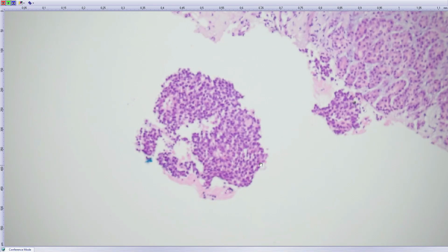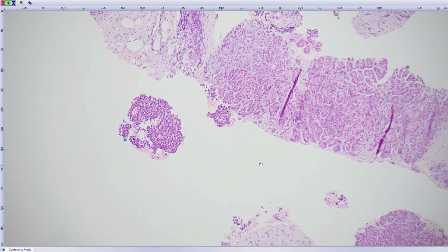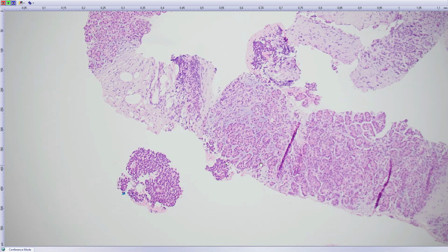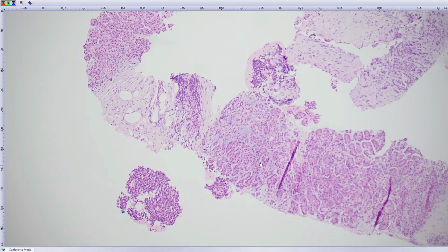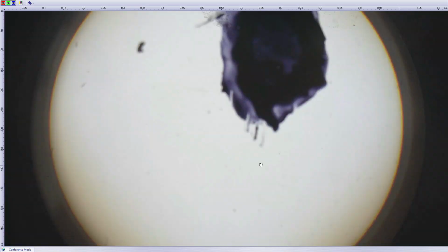So if I see something like this in the pancreas, I will mentally go through all the possibilities if it could be some primary tumor of the pancreas, and the answer is it doesn't look like a primary tumor of the pancreas, or it's something very, very rare primary in the pancreas. Okay, so the most important differential diagnosis in this case would be small cell carcinoma.